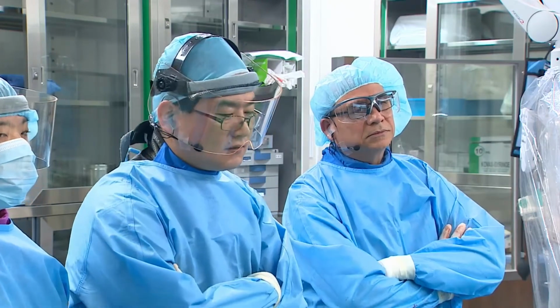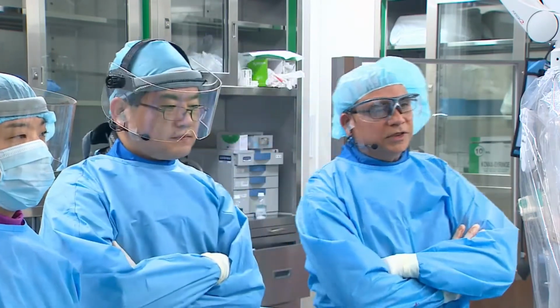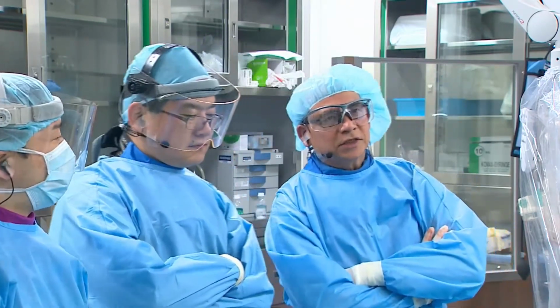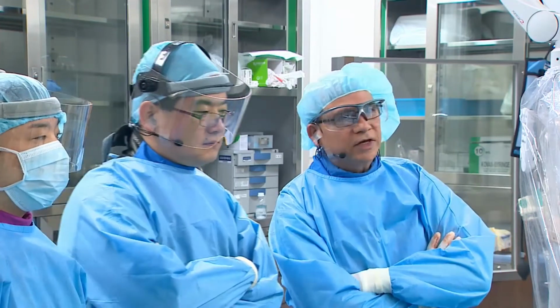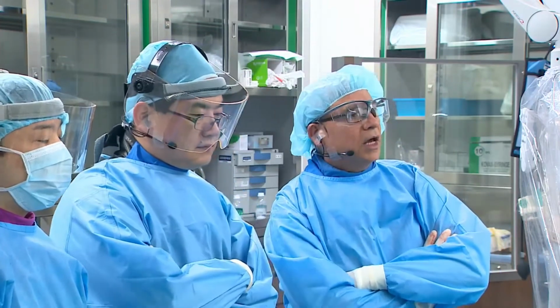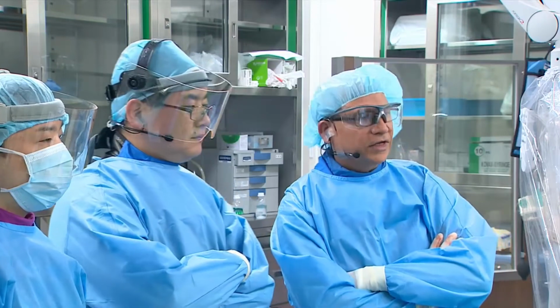Dr. Kishore? Well, we had discussed it, and because there was no obvious stump in the left common iliac, the need for access via the brachial may be needed. So we elected to prepare both groins as well as the brachial to allow antegrade passage of a wire if necessary.